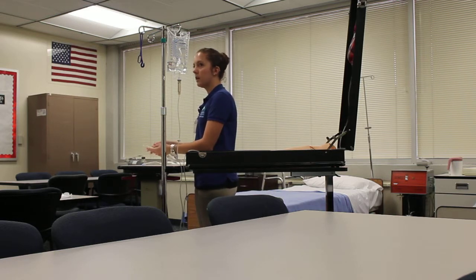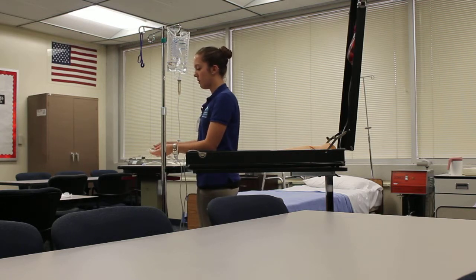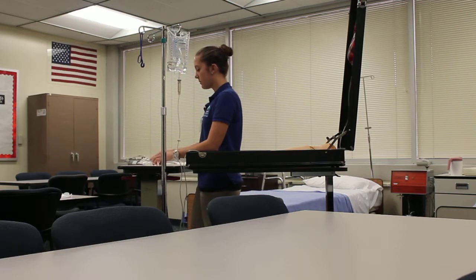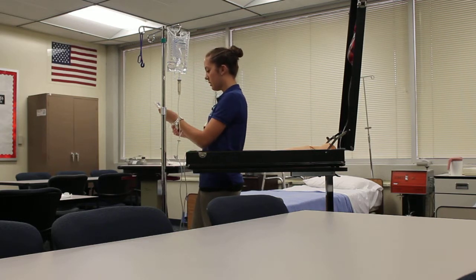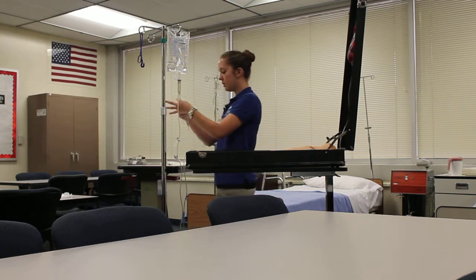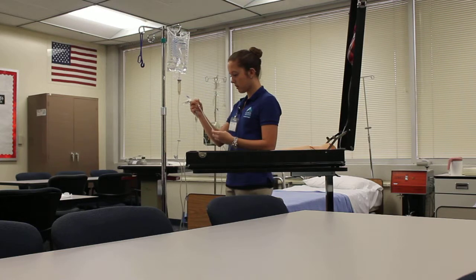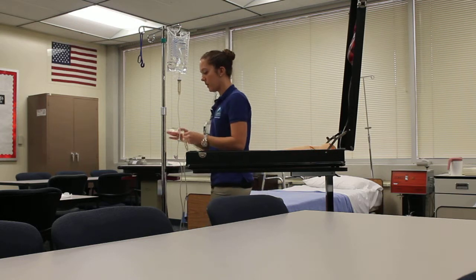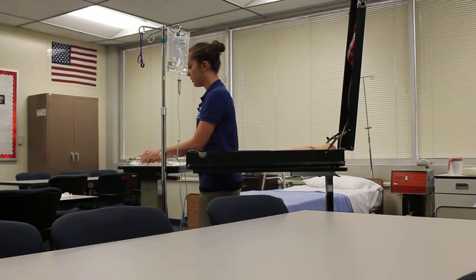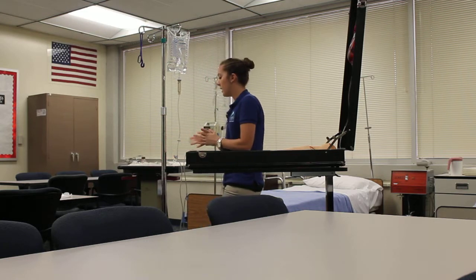and I will label the bag with the drug, the amount, the dose, the route, the infusion time, the date, and my initials. I can go ahead and spike my bag using my secondary tubing. I'm going to prime the drip chamber, unclamp my tubing and prime the tubing, make sure all the air is out. Once I've done that, I'm going to label my tubing with my initials as well as the date and time.